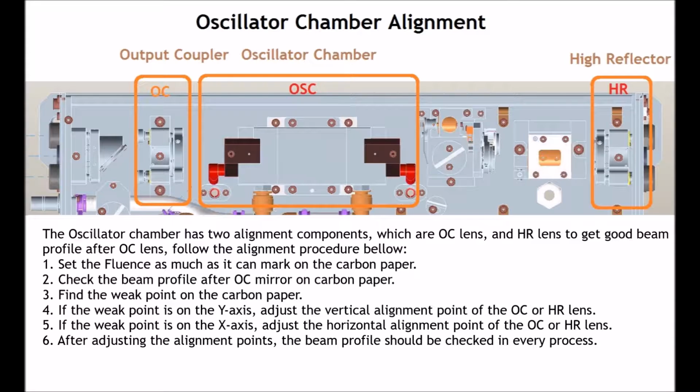1. Set the fluence as much as it can mark on the carbon paper. 2. Check the beam profile after OC mirror on carbon paper. 3. Find the weak point on the carbon paper. 4. If the weak point is on the y-axis, adjust the vertical alignment points of the OC and HR lens. 5. If the weak point is on the x-axis, adjust the horizontal alignment point of the OC and HR lens. 6. After adjusting the alignment points, the beam profile should be checked in every process.